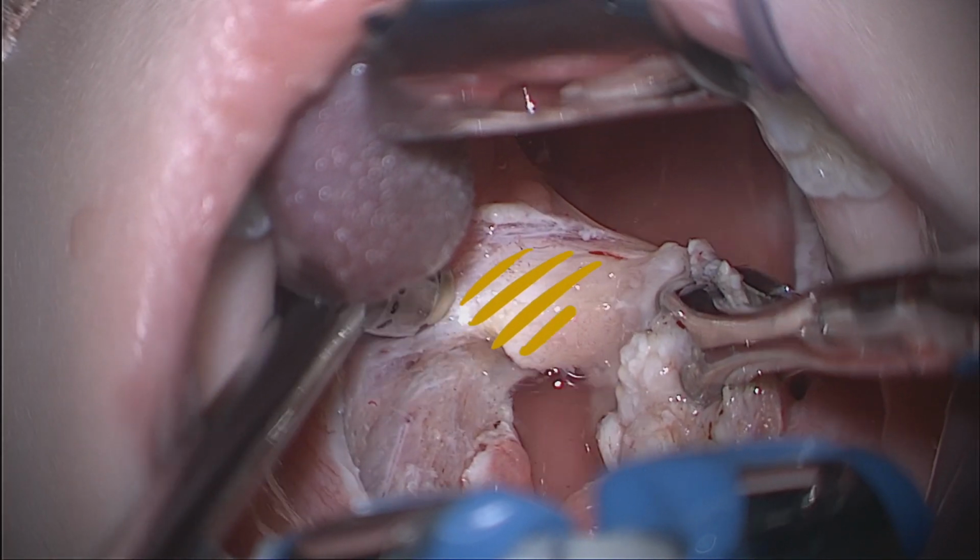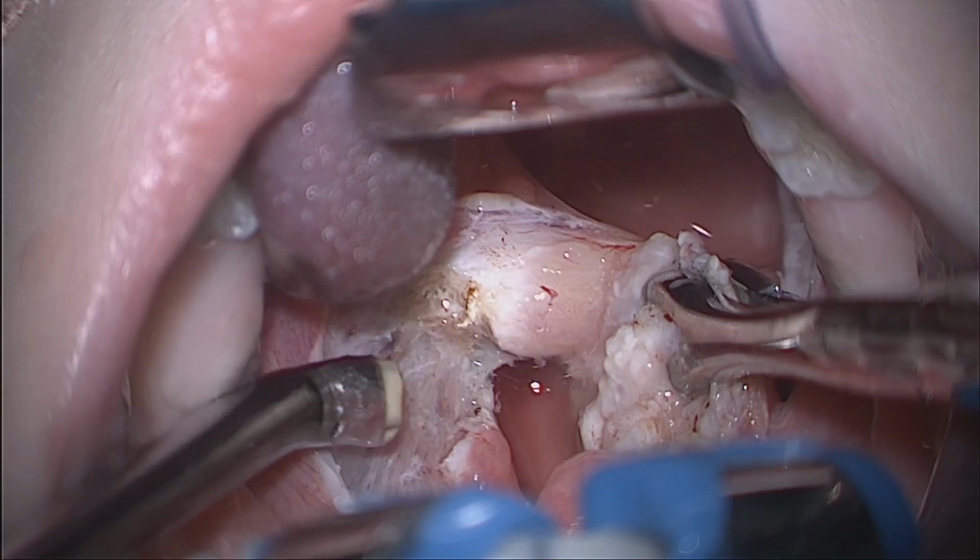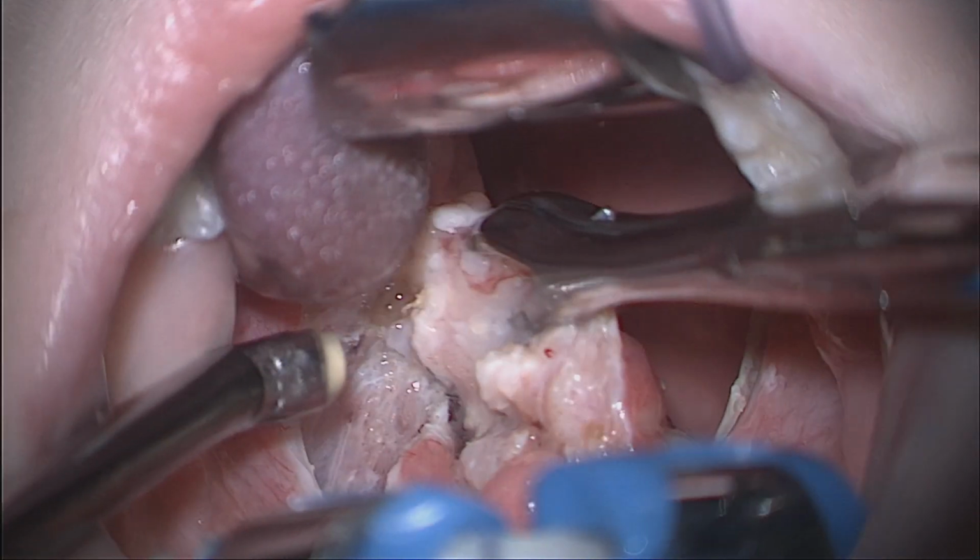Care must be taken not to transect the tonsil and to ensure that the capsule has been dissected around circumferentially.